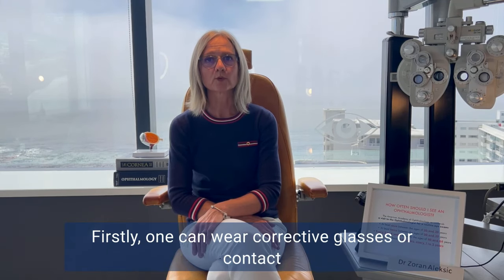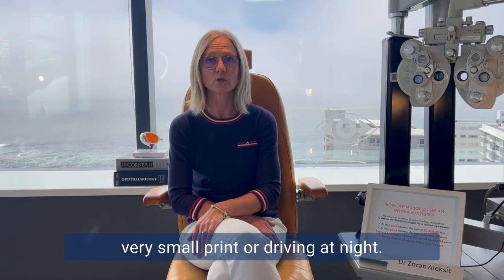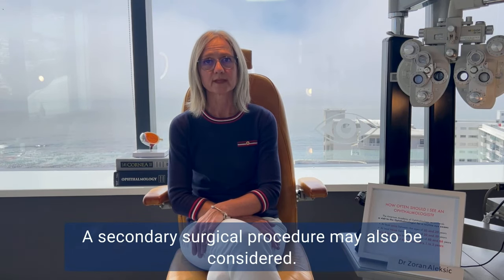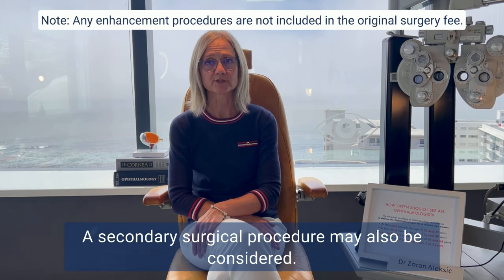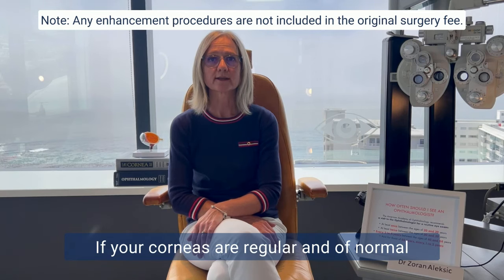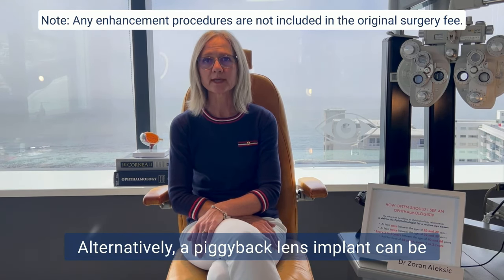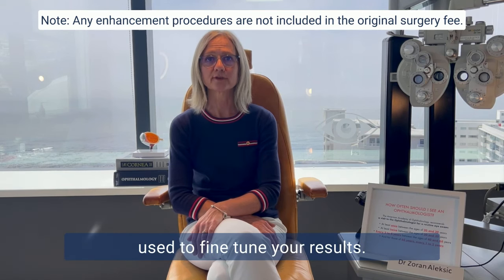Firstly, one can wear corrective glasses or contact lenses if and when needed, like for reading very small print or driving at night. A secondary surgical procedure may also be considered. If your corneas are regular and of normal thickness, laser enhancement might be an option. Alternatively, a piggyback lens implant can be used to fine-tune your result.